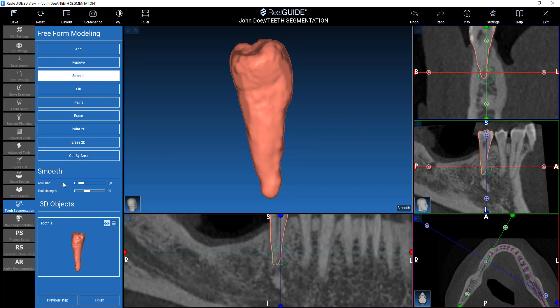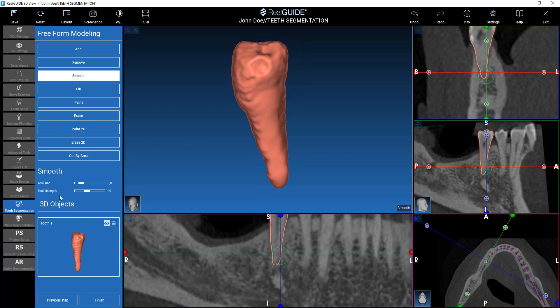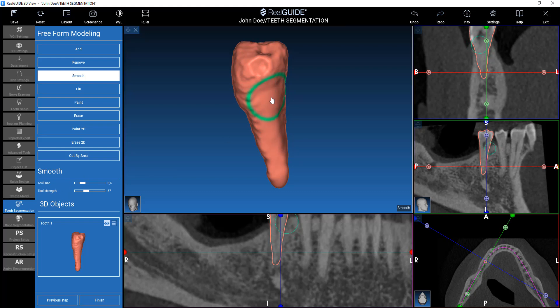All the tools work the same way as the freeform modeling tools we saw in the previous tutorials. Tool size increases or decreases the operation — you can change it with a shortcut by clicking Shift and mouse wheel. If you want to change the tool strength, click Ctrl and mouse wheel. The color changes according to the power of the tool.